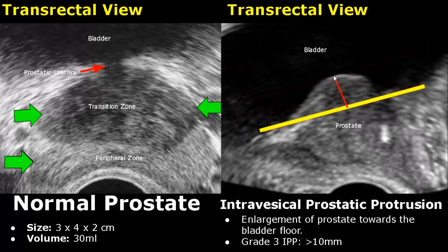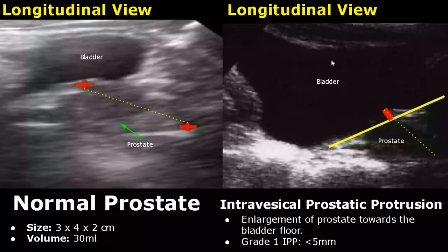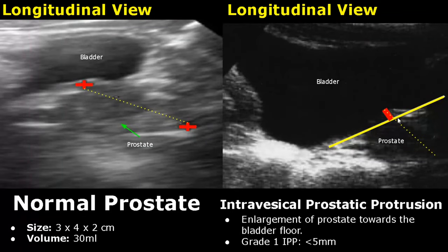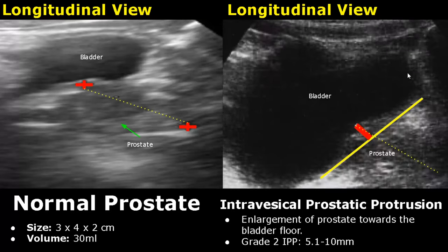In grade 3 intravesical prostatic protrusion, the value will be more than 10 mm. Now we have a transabdominal approach with longitudinal views. This is the imaginary line for easier understanding of protrusion, and the grading is similar. Grade 1 IPP measures less than 5 mm. This image shows a grade 2 IPP, measuring between 5.1 to 10 mm.